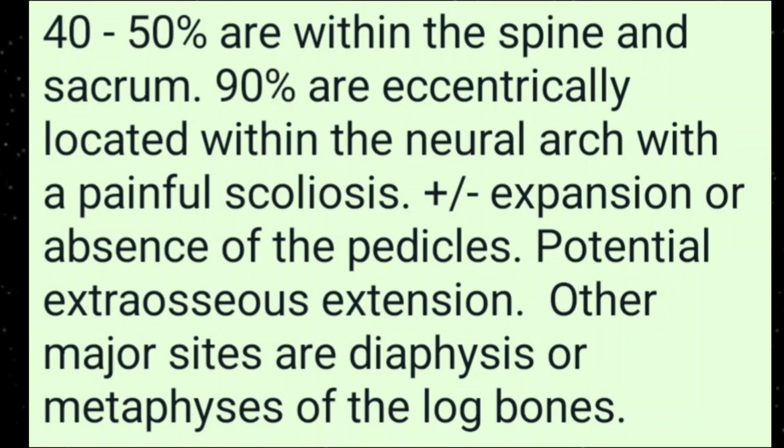But particularly when the patient presents with pain and the age is between 10 and 30 years, and there is pain in the backbone, always search the neural arches and always look at the pedicles.